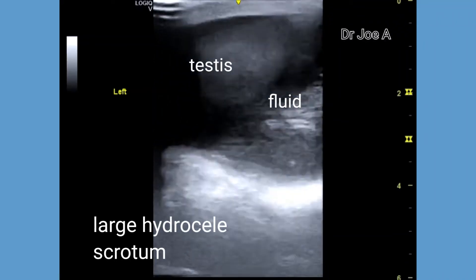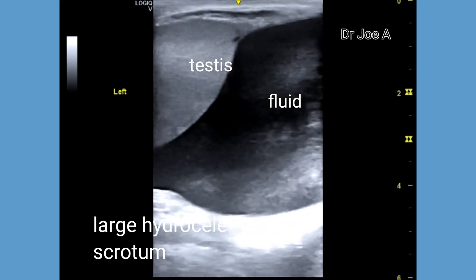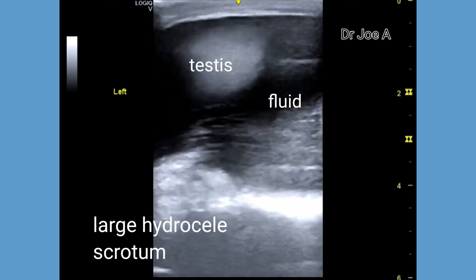This adult male shows the large hydrocele of the left scrotum. He had a painful swelling of the scrotum.